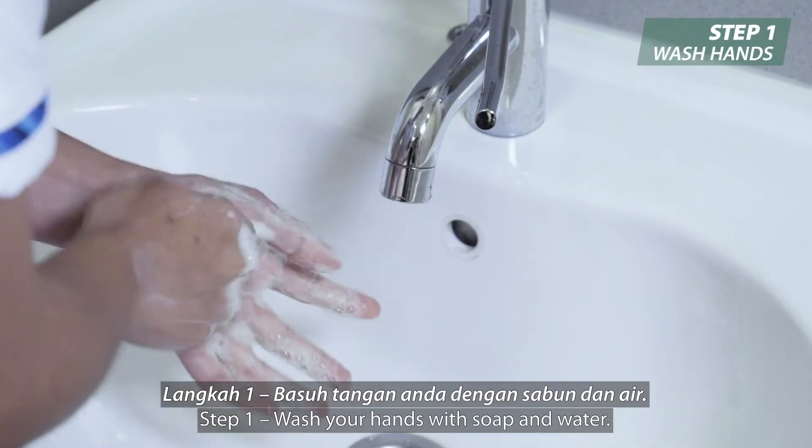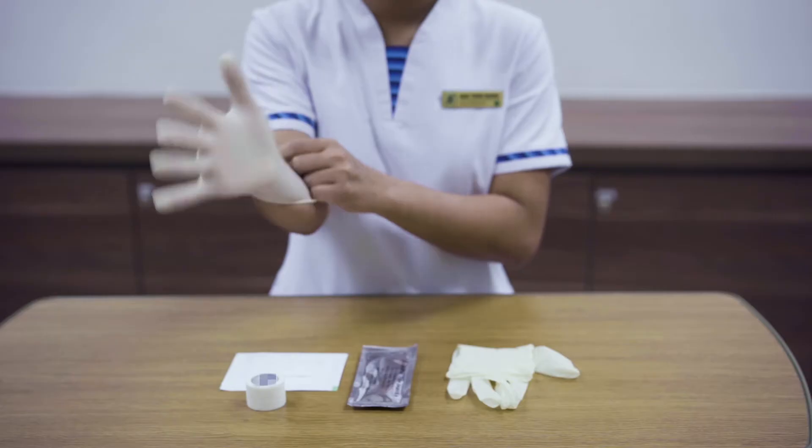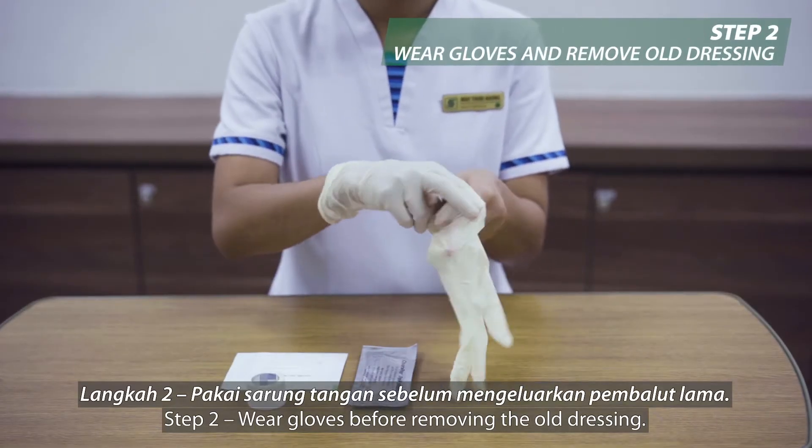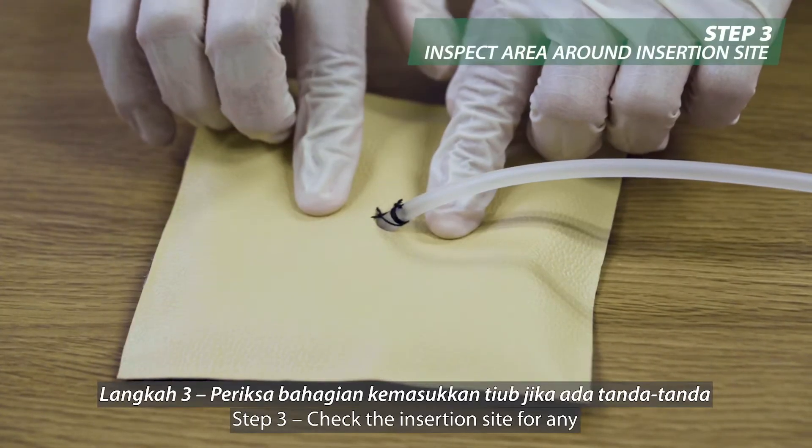Step 1: Wash your hands with soap and water. Step 2: Wear gloves before removing the old dressing.